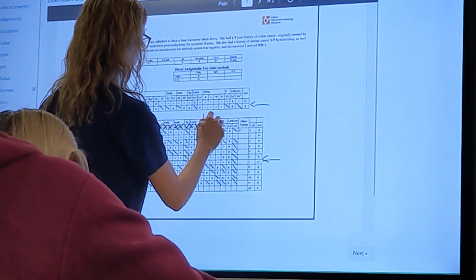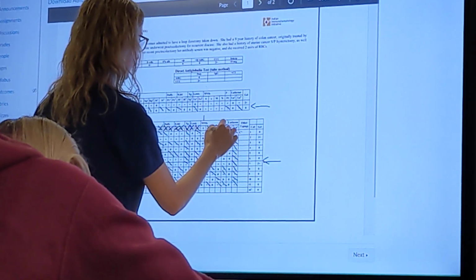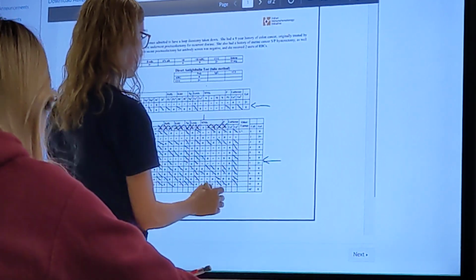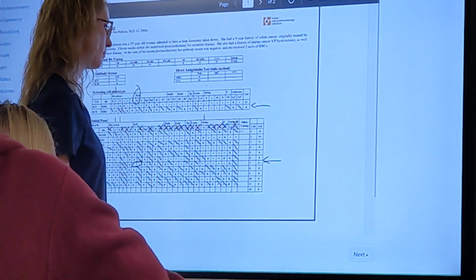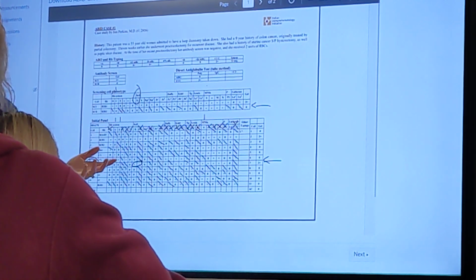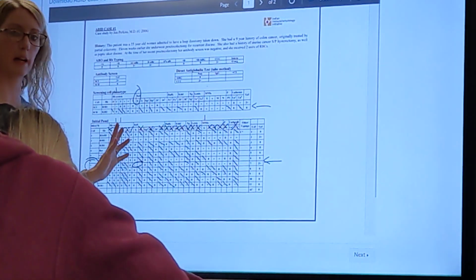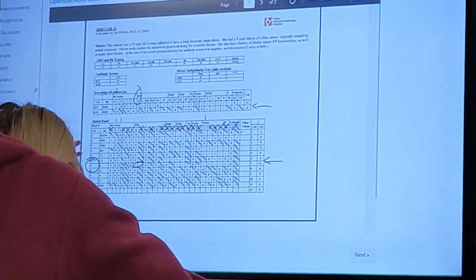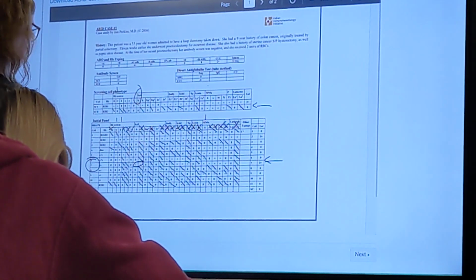M, I have 3. N, I have 3. P1, I have a bunch. Lutheran A, I'm not worried about. Only one antigen positive cell out of all those, I'm not worried about. I ruled out Lutheran B. So I'm not gonna mark out Lutheran A, because I didn't rule it out, but it's not really clinically significant anyway. So I'm just not gonna put anything, and even on my answers, if I put unable to rule out something, I'm not gonna list that one, just not gonna do it.